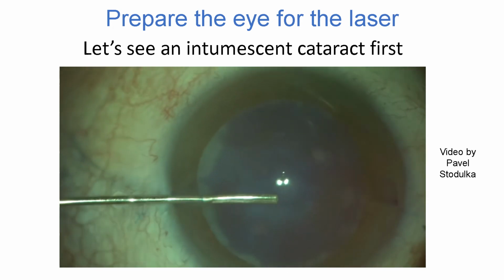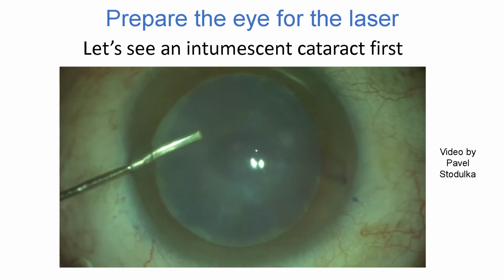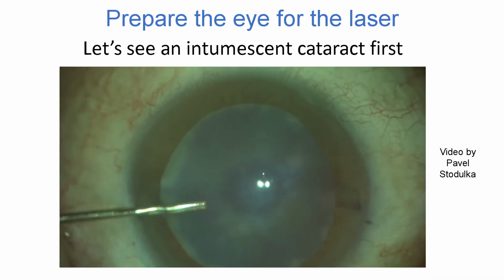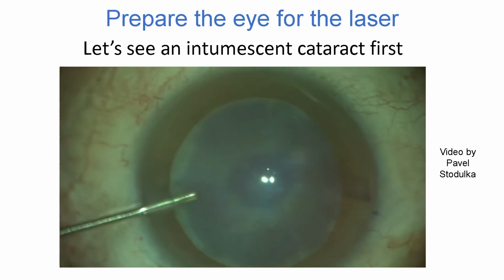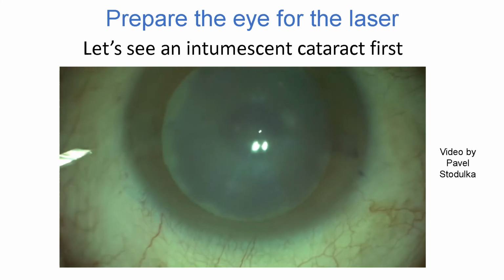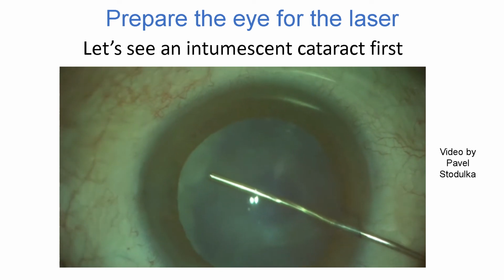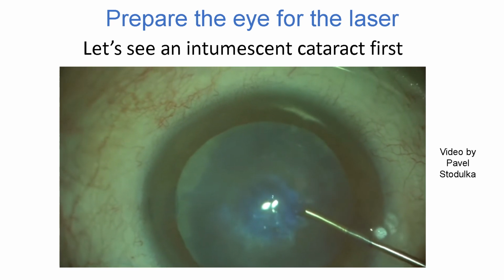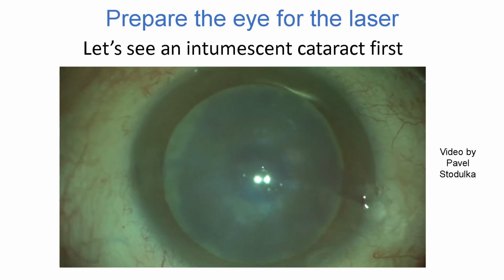As you continue to do the washout, you'll see that an interesting feature becomes obvious, which is at the center of the capsule, which is also going to be coincident with the visual axis. There is enhanced staining of the capsule, and you'll be hearing more about this later on in this session. It's important now to overfill the anterior chamber with an optically clear solution of 2% sodium hyaluronate, so the chamber is nice and firm.